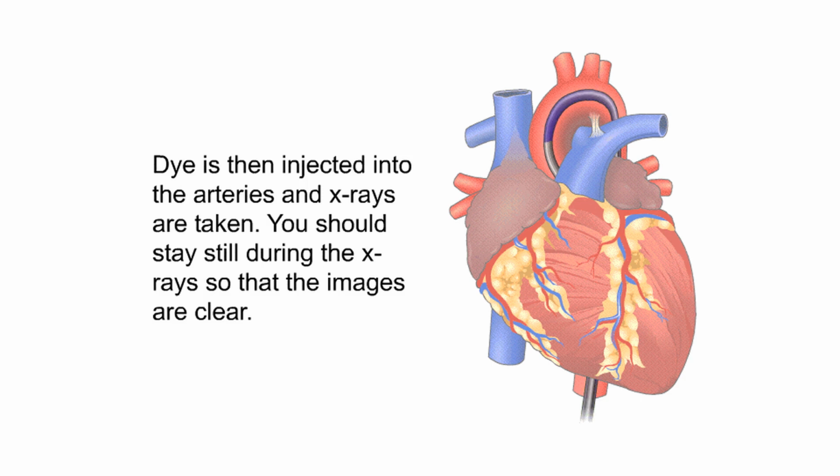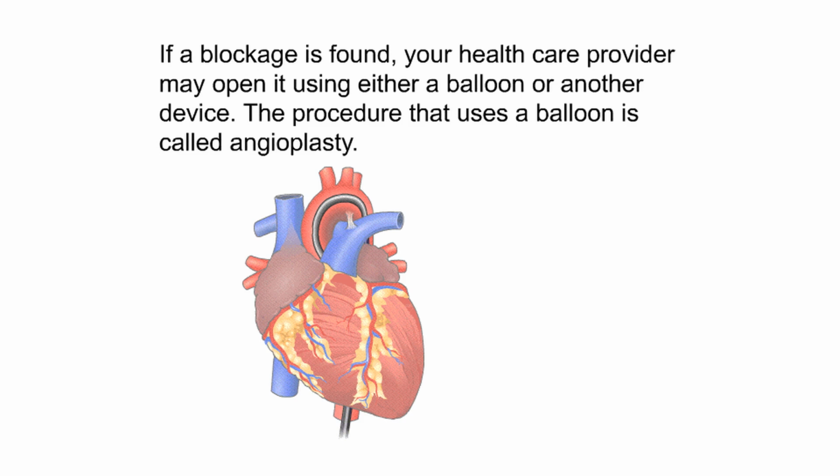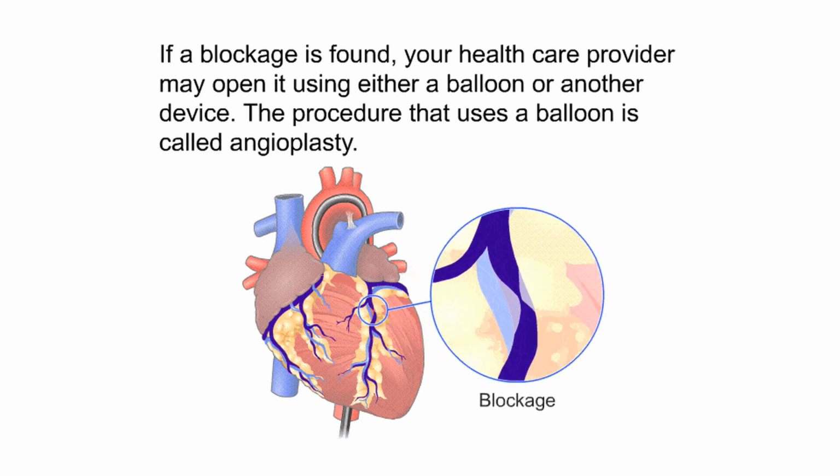Dye is then injected into the arteries and X-rays are taken. You should stay still during the X-rays so that the images are clear. If a blockage is found, your healthcare provider may open it using either a balloon or another device. The procedure that uses a balloon is called angioplasty.